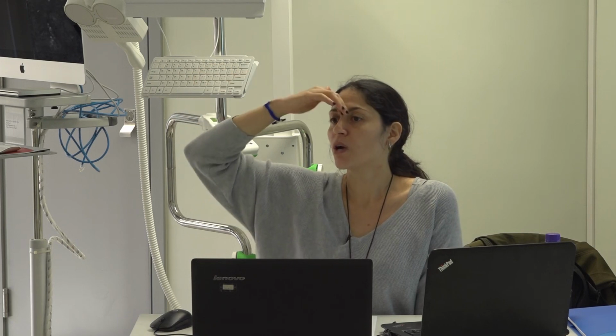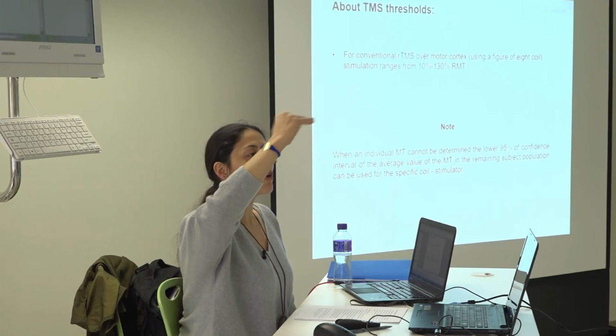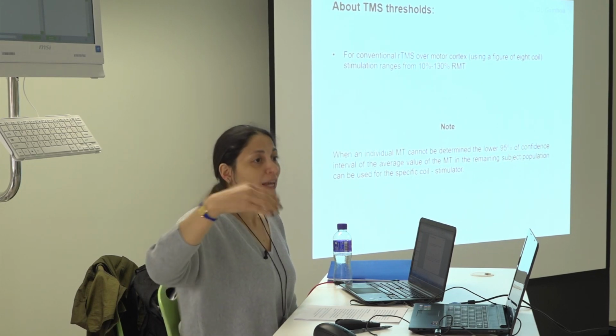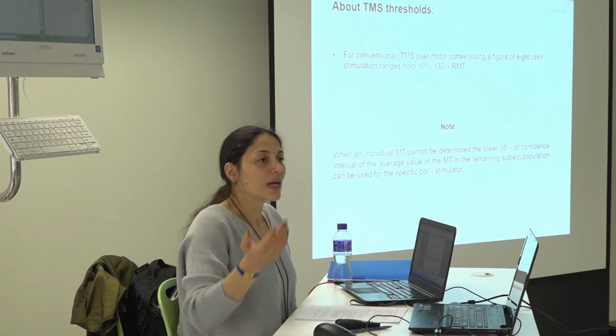So you can also, when you are going to do a study, what you can try to do is, some people use just one fixed threshold for everybody. For example, 70% stimulator output, and everybody will receive the same stimulation. It is safe. Well, it has been done. You can do it. But it's not individualized, right? So as long as it is inside this frame of 130% resting motor threshold, it could be used.